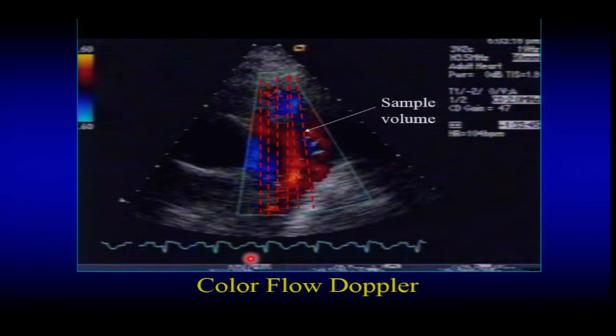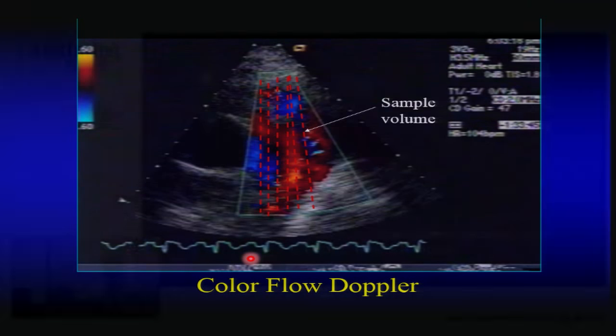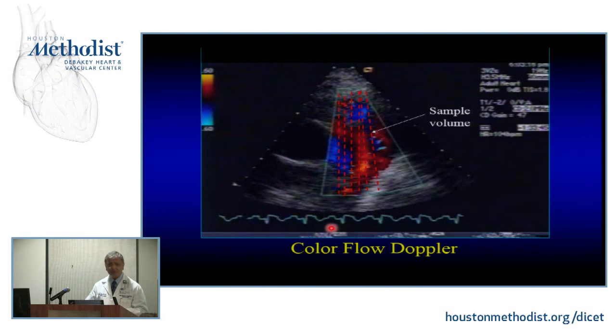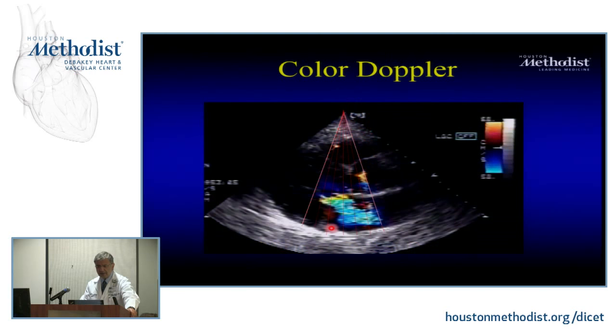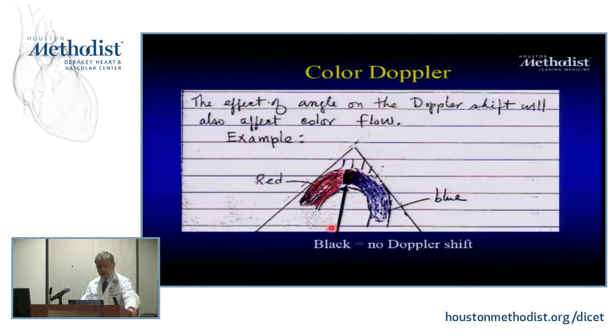And it took a few years for people to acquiesce and agree that going away from us is going to be blue shade and coming towards us is going to be in the red shade. At least we don't have controversy regarding that. Okay, so I think the utilization of that certainly in abnormal jets, etc., we'll talk about those sometime down the line.